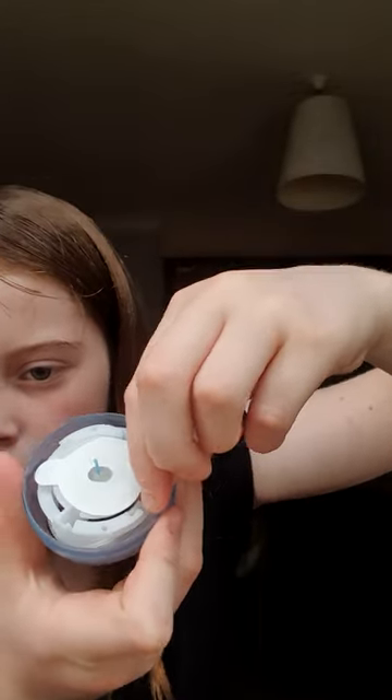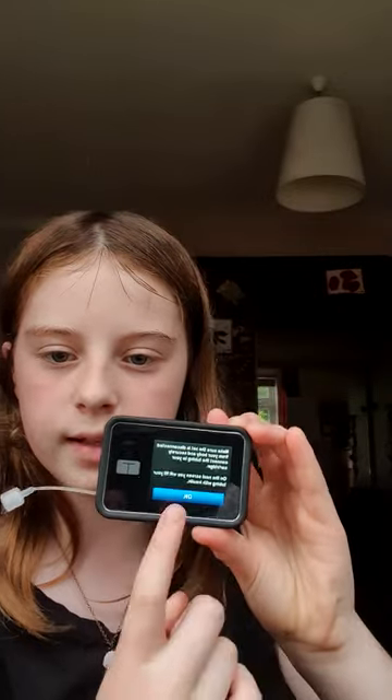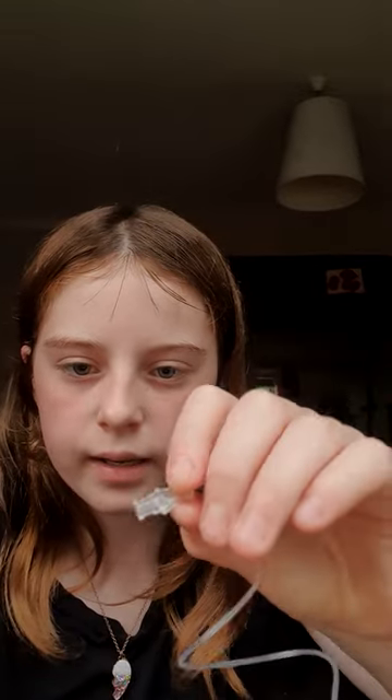Then you'll see here you can unhook that. You may realize that this button is here, so just press it — but don't press anything else. Then you will see on this that there's a little groove to place the wire on. If it jumps out again that's fine, just put it back in. Then you'll get this bit and connect it to here tightly, as far as it'll go — you won't need to spin that much.